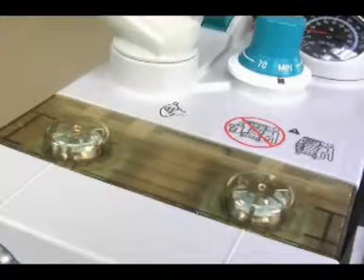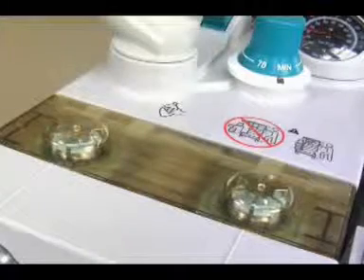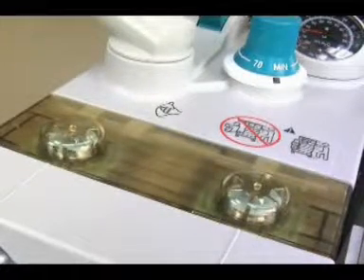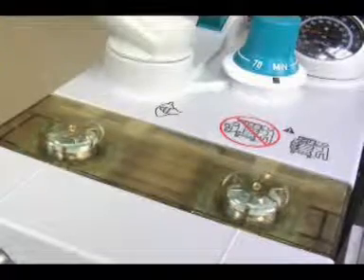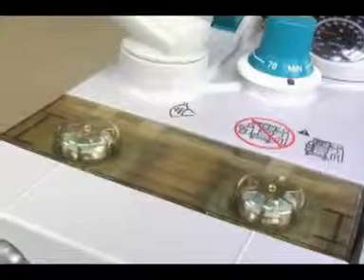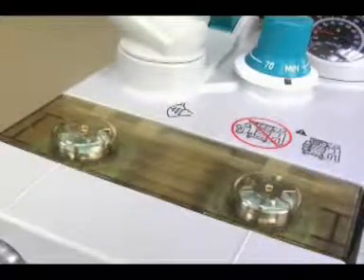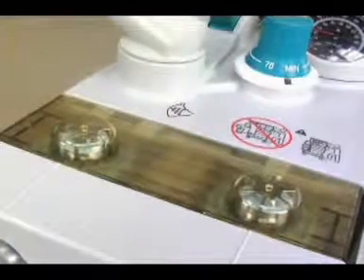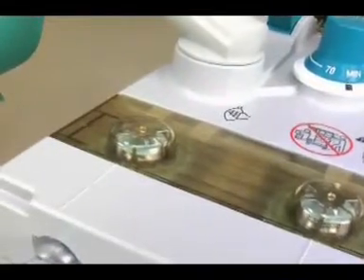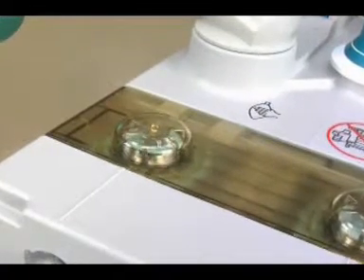Unidirectional valves are used in the circle system. As gas flows forward, the disc is pushed upward. This allows gases to flow toward the patient for inspiration and away from the patient for expiration. During inspiration, the expiration valve is closed to avoid rebreathing of CO2 and exhaled gases. The inspiratory valve closes during expiration to avoid mixing of exhaled gas with fresh gas.